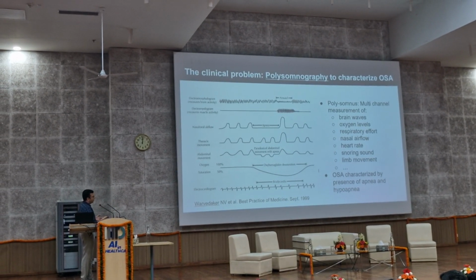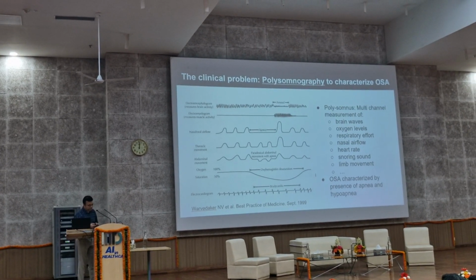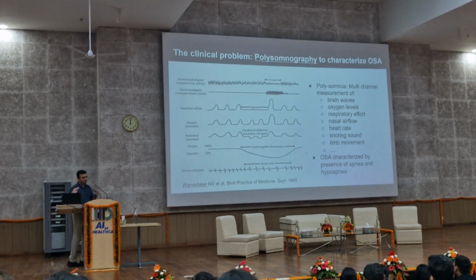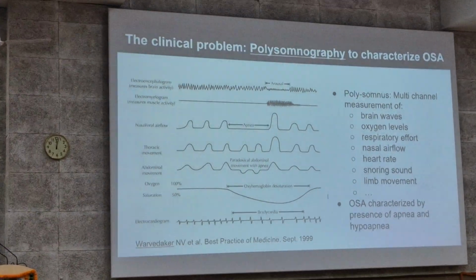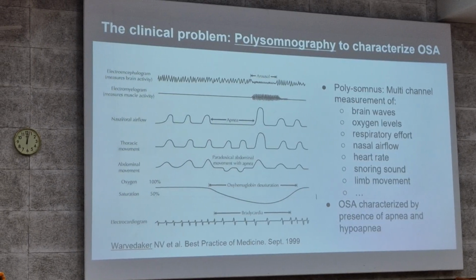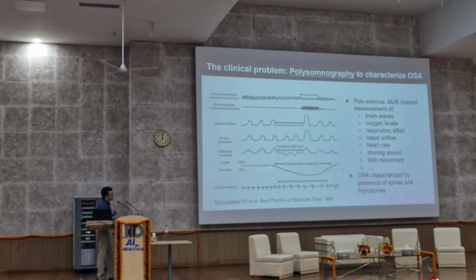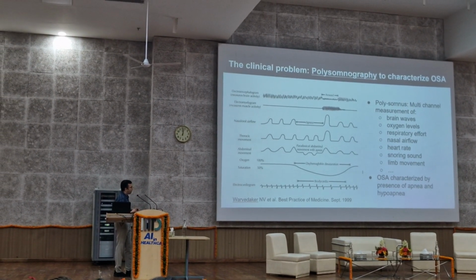that are being repeated overall. What is OSA, or obstructive sleep apnea, is characterized by a certain kind of pattern, right? So it's a pattern matching problem in that sense, and that pattern is of apnea and hypopnea, which again Dr. Sanjeev talked about, which is characterized by this long pause where you don't see any airflow. It's further characterized by a certain drop in oxygen. This is when you have hypopnea.